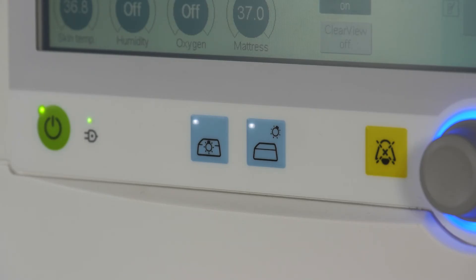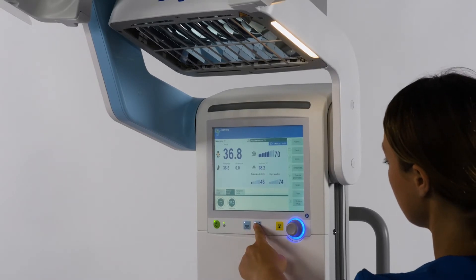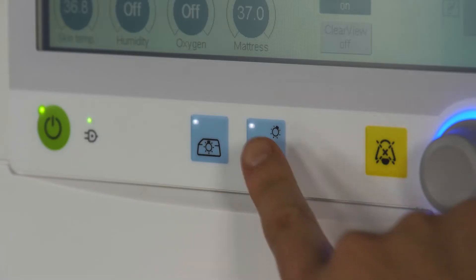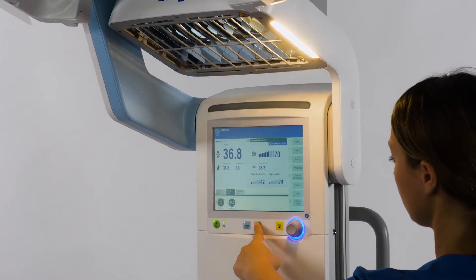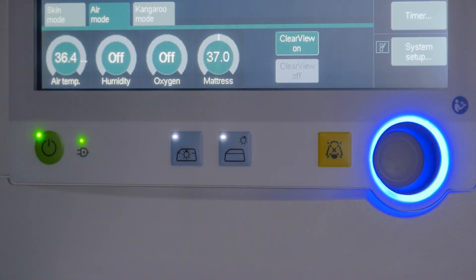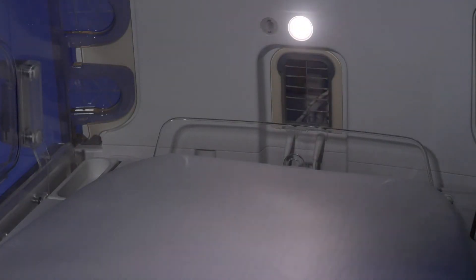When operating the lights in Baby Leo, you need to use the key switch as shown on the screen. Use the key to switch the working light on the radiant warmer on and off. When using this light, you have the choice of three different light intensities. For the night light function, again use the key to switch the light on and off.